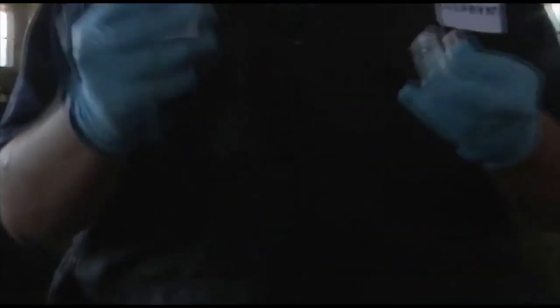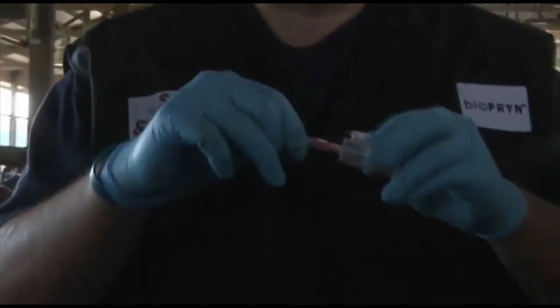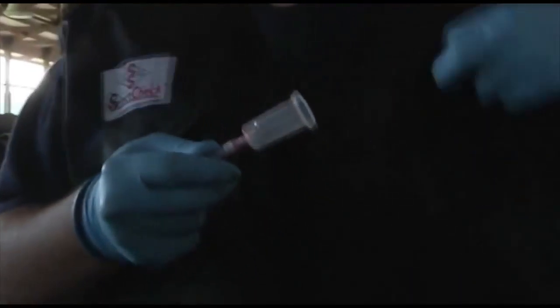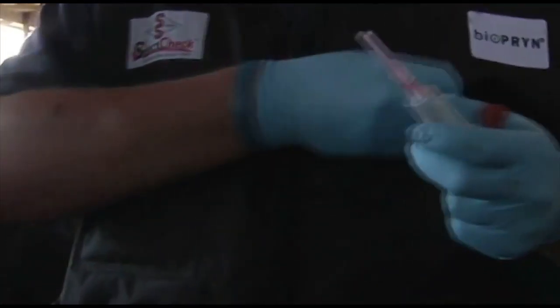We're going to take two cc's of blood from these cows. The process begins by taking a needle, separating it out, and screwing it into the hub. Then we have our vacuum tubes, which are used for blood collection.